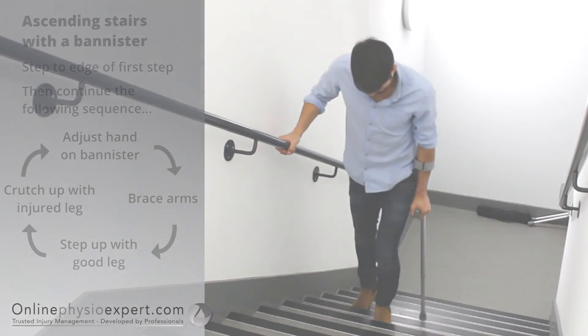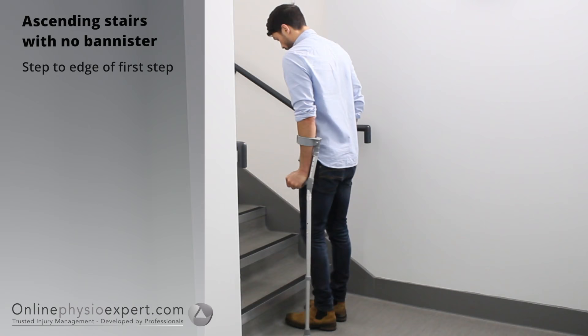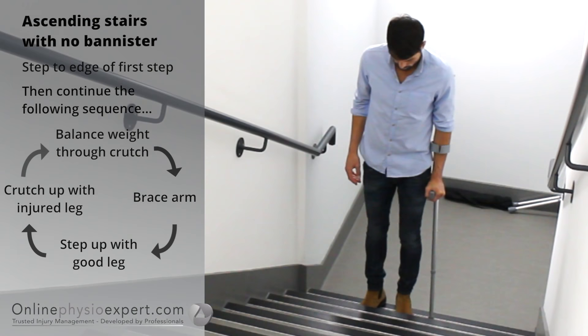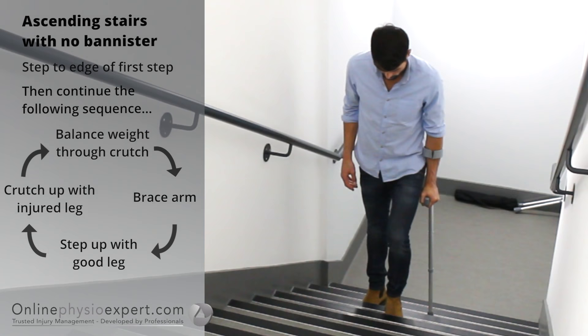To ascend stairs with no banister, step your feet to the edge of the first step. Find your balance point through the crutch and your injured leg. Step your non-injured leg to the next step followed by your injured leg and the crutch. Repeat these sequence of movements until you safely reach the landing.